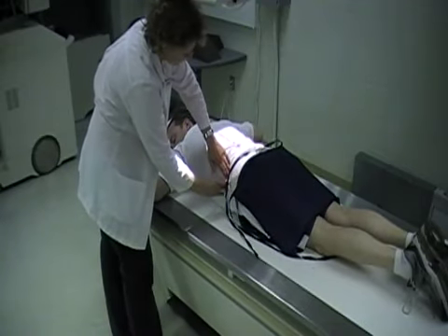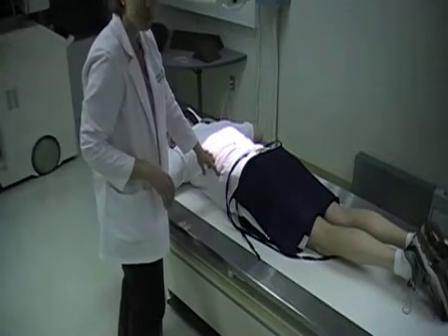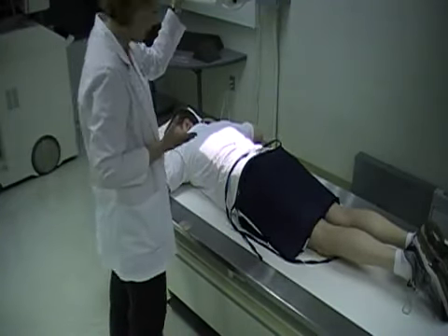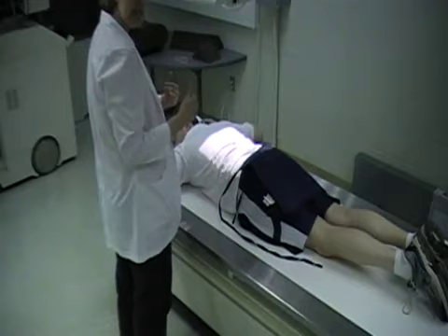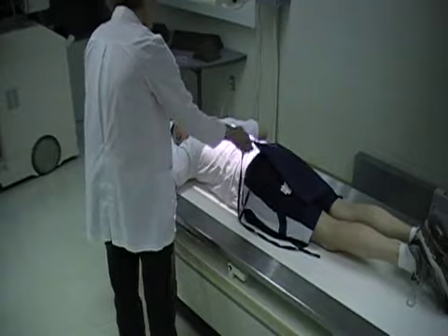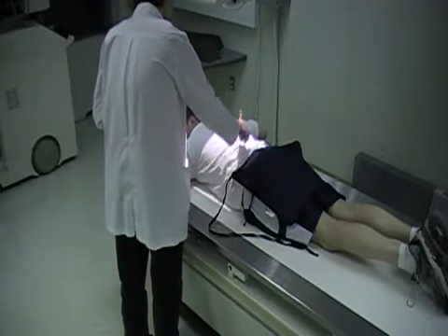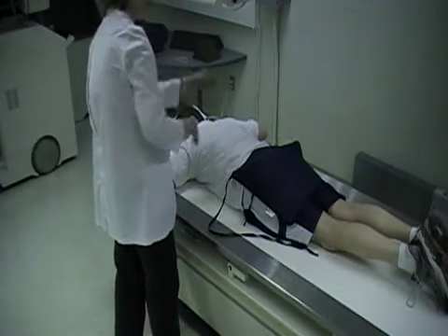Palpate the bottom edge of his ribs, and then you're going to center your transverse line 1 inch to 2 inches above that bottom edge of the ribs. Now, if you're using a smaller image receptor, the 11 by 14, you want to be sure and off-center this to the left. So I'm going to move it to the left, and you always want to check and make sure that you are going left and not right. This is his left side, there's his mid-sagittal, that's the edge of his body. We're going to go halfway.